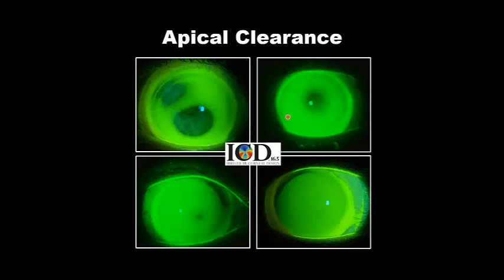The average sinking of a scleral lens, or at least an ICD, is around 150 microns. So over the course of the day, whatever apical clearance you have, you're going to have 150 microns less. So it's important to start with enough vault in the center to allow for that sinking.